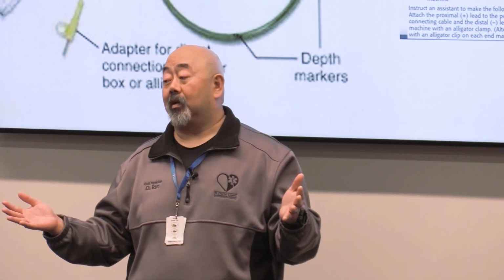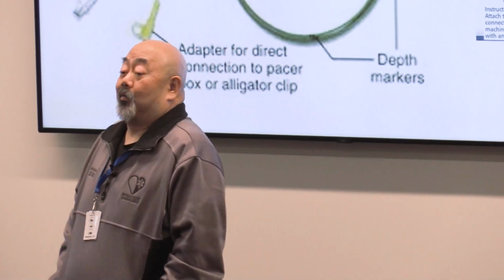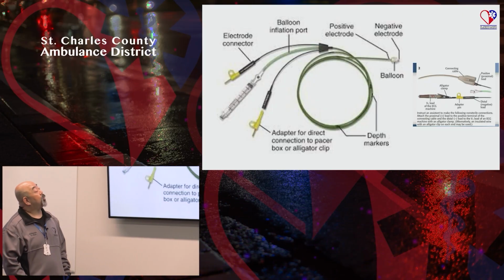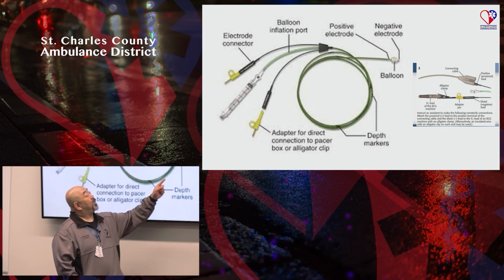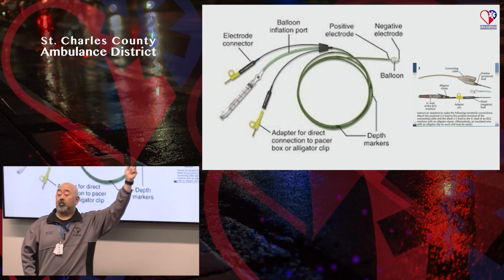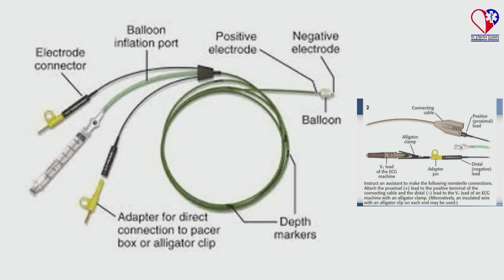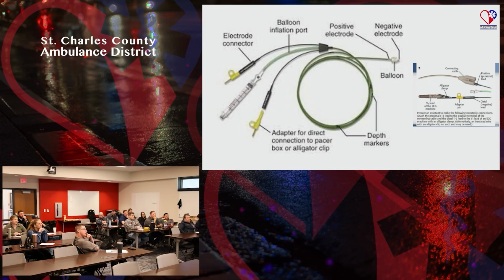It's all operator preference. One way is not better than the other, but that's why they have it in these kits, just in case you were wondering, why do some people use it, why do some not? That's why. The balloon. Why would we have a balloon on the end of this thing? Is that to hold it in place, or is there another reason? Someone said it floats.